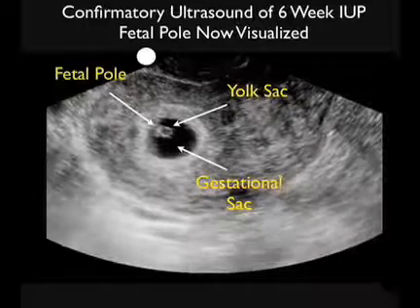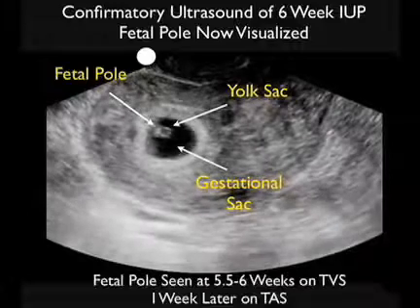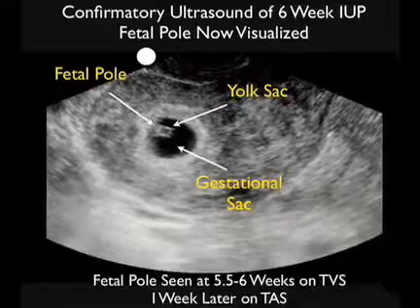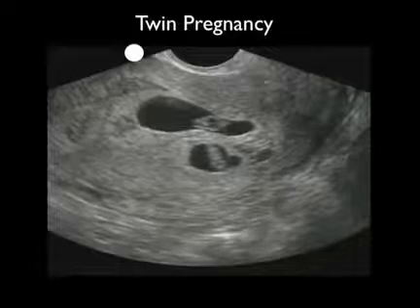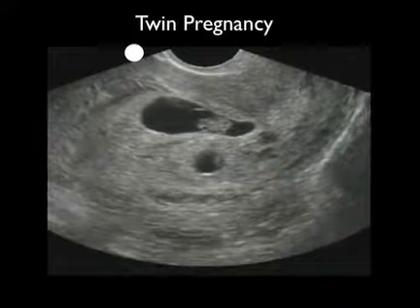And let's look just to the left of the yolk sac here, and now we appreciate the presence of a tiny fetal pole. Interestingly enough, when we magnified the fetal pole, we could actually see a tiny heartbeat. Now, the fetal pole is generally seen at about 5.5 to 6 weeks on transvaginal sonography and 1 week later on transabdominal sonography.